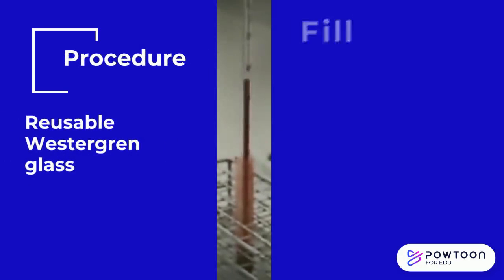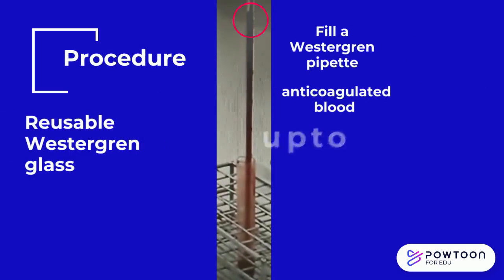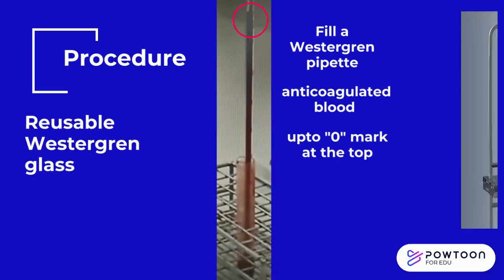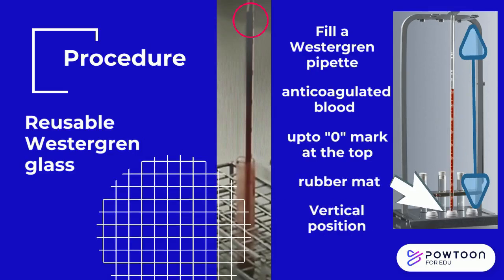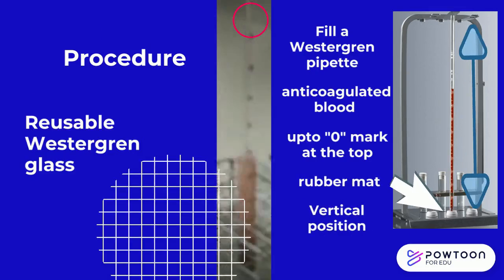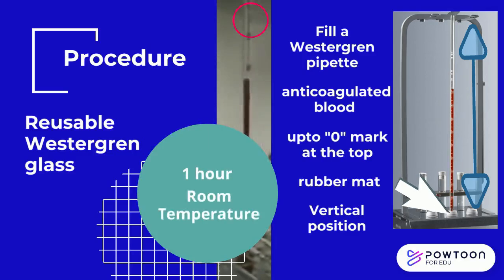Procedure using a reusable glass Westergren tube: pipette anticoagulated blood to the zero mark of the Westergren pipette. Place the tube in the sedimentation rack with clamps that hold the lower end of the pipette tightly against a rubber mat in a vertical position. Ensure that the rack is level, and allow the pipette to stand undisturbed for 1 hour at room temperature.